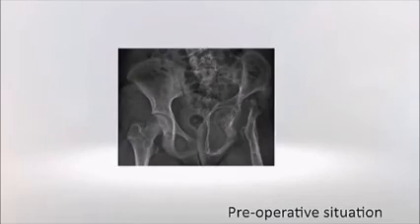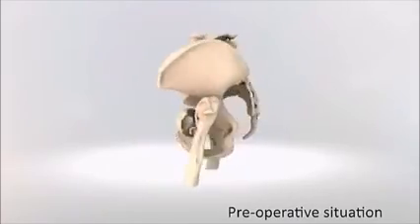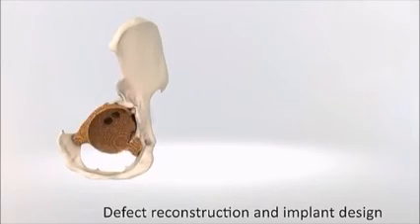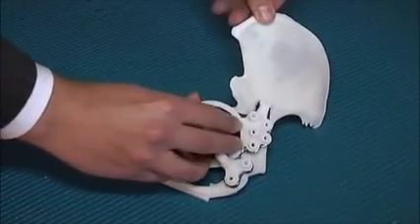The teenager's recovery is the result of a technological revolution. Traditional treatments for Falassian's degraded hip just weren't adequate. So in 2012, her doctors recommended she be measured for customized 3D printed hip implants, courtesy of Belgian company Mobilife.